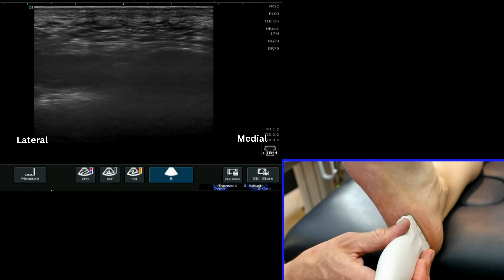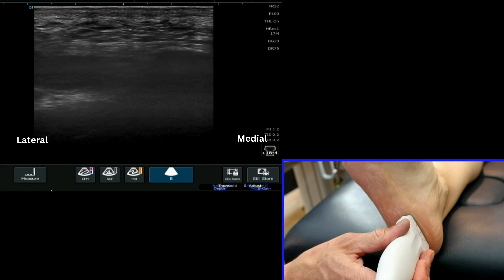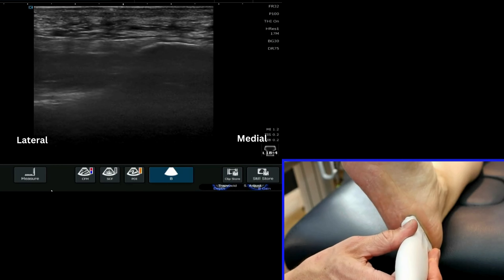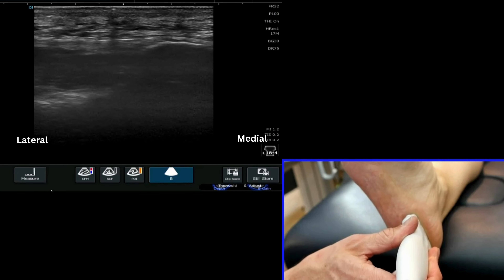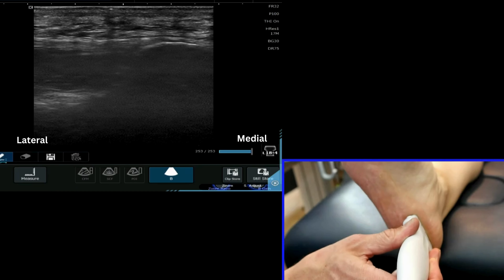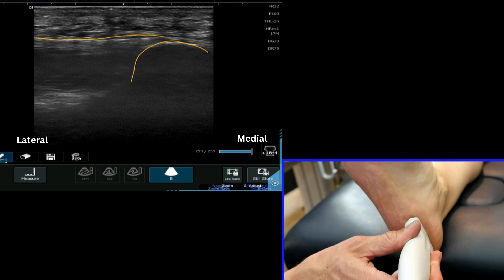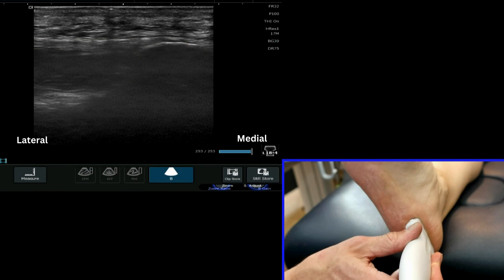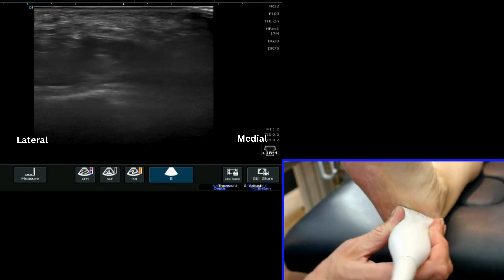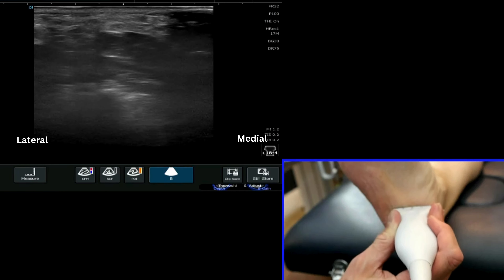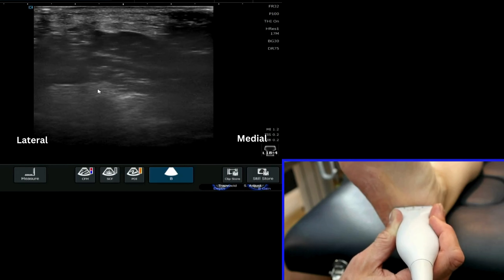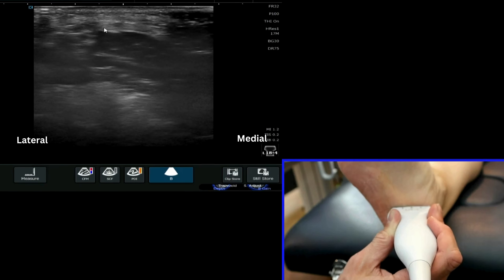Starting on the lateral aspect of the plantar aspect of the foot, we begin by identifying the skeletal landmark of the calcaneus, which we can see here clearly on screen. From this, the central cord of the plantar fascia attaches. Moving the probe slightly distal and spinning round into short axis, we can see the plantar fascia here with the cursor.